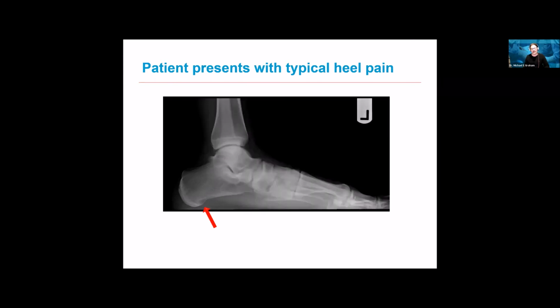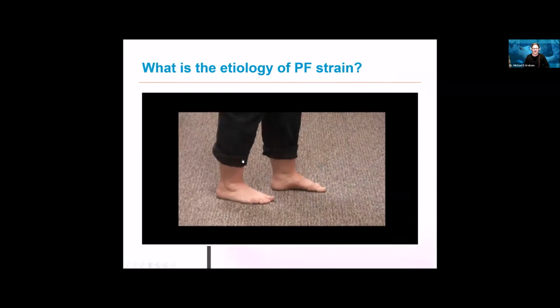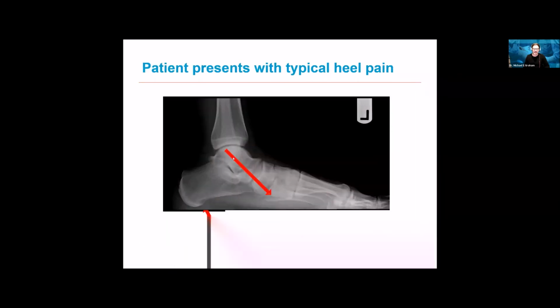Well, let's take a look at the entire foot structure now. So what's the first thing that you see? Obliterated sinus tarsi, a pathologic talar declination angle. The navicular has dropped. We have an anteriorly deviated cyma line. So we have this primary pathology that's occurring above the heel that is now creating the strain on their plantar fascia. And it's that strain that is continuous.